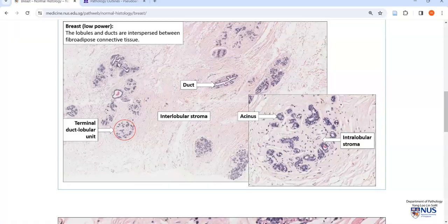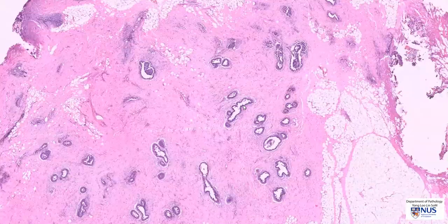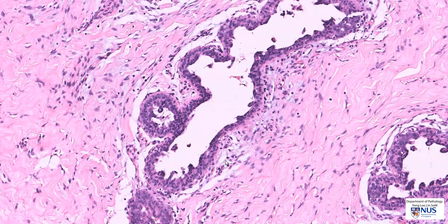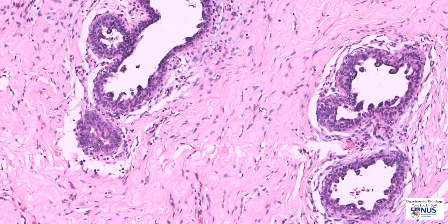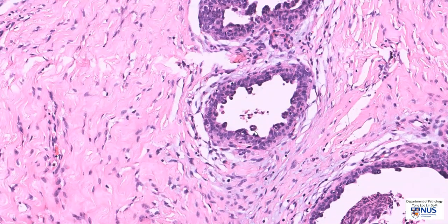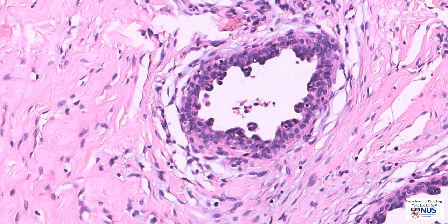Going back to gynecomastia, we only see ducts and we don't see lobules, and these ducts are lined by benign epithelial cells. Often in gynecomastia, we can see some degree of epithelial hyperplasia. Moving around in some of these ducts, the lining epithelium is more than two cells thick.